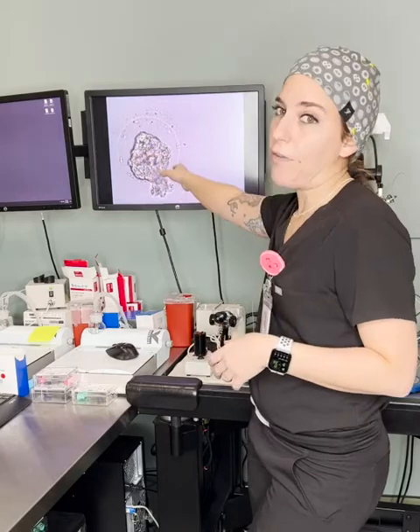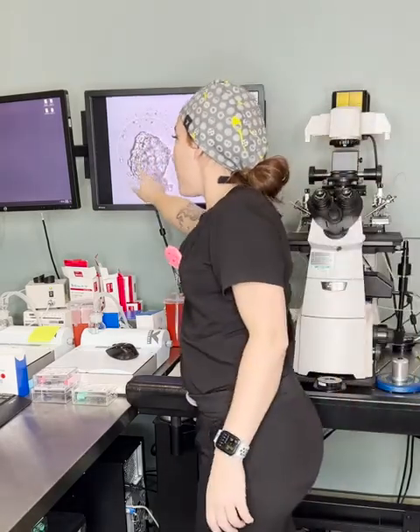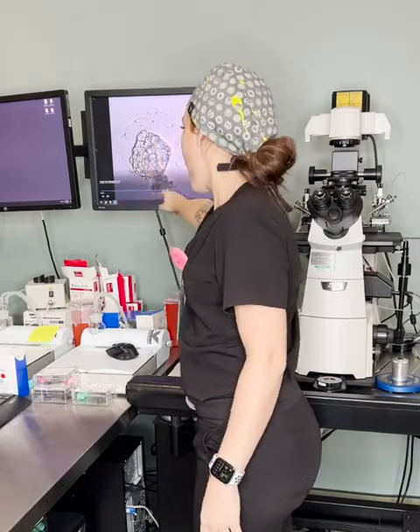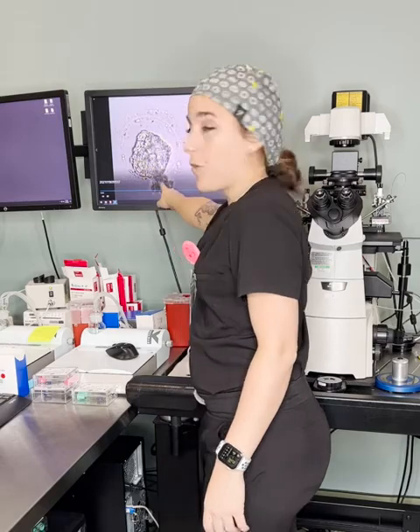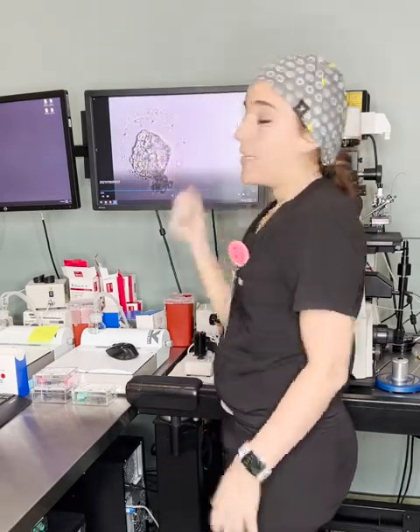Okay, so this is an FET that we had done. This is the collapsed embryo. You can actually see the ICM here. Trophectoderm. You can start to see the cavity already forming. The embryo is already hatching because this was probably a biopsied embryo. So as you can see, they start off very, very small.